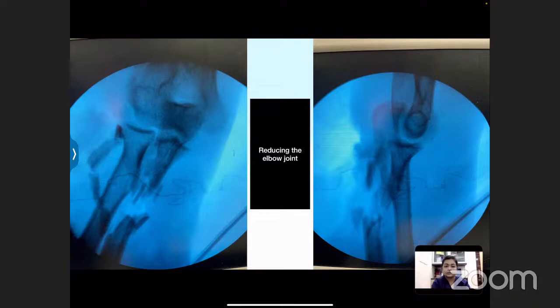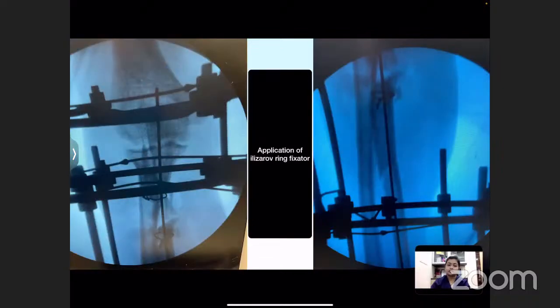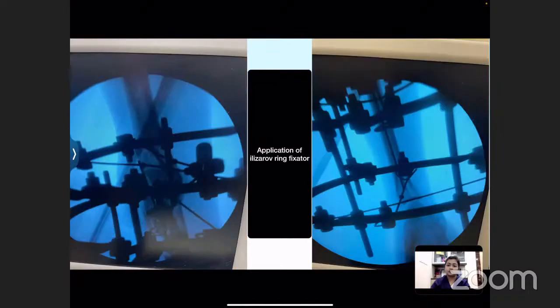Then, there is a proximal comminuted fracture of the ulna, and a shaft fracture of the ulna is also present. First I stabilized with the wire and tried to connect those pieces which are still holding with the soft tissue. I don't want to remove all the pieces. Whichever is holding with the soft tissues, I kept intact. Then I applied the frame on the distal humerus and the proximal ulna, and stabilized the fracture. And here, one minute, I'll try to play this.